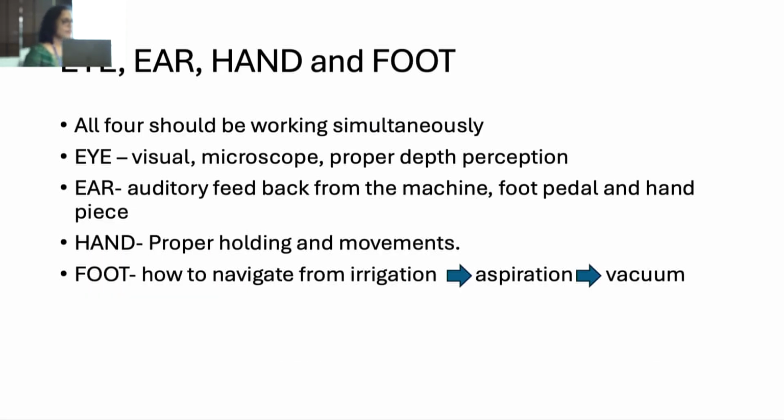In SICS, basically our eyes, mind and hand are working. In Phaco, everything should work together: eye, ear, hand, foot, and mind. With regard to the eye, the visual microscope and proper depth perception. Depth perception is more important in Phaco compared to SICS. Then ear, auditory, and hand coordination, and foot pedal, how to navigate your foot pedal.